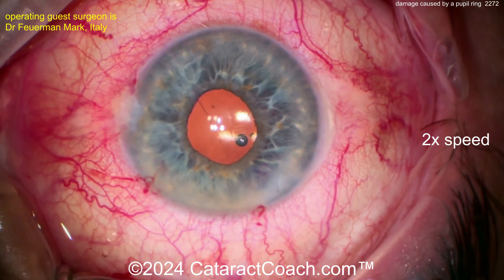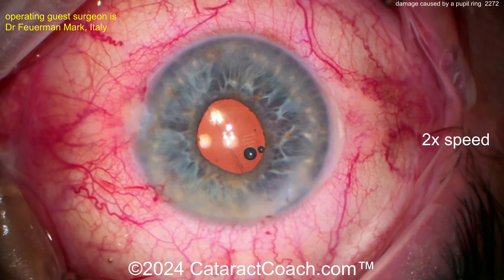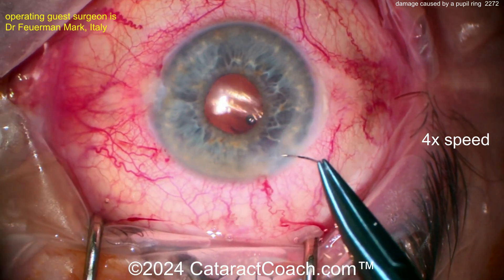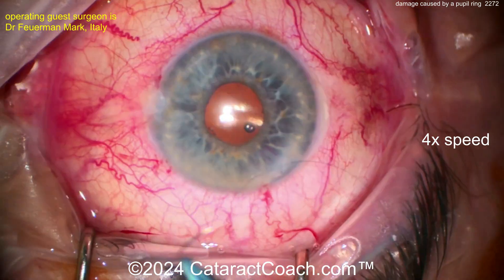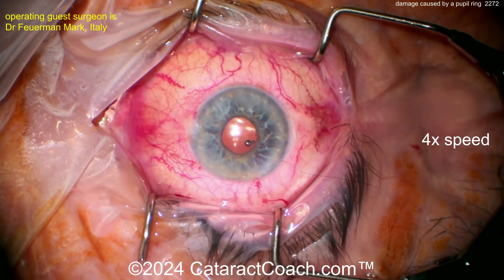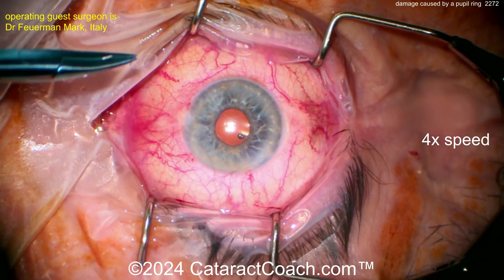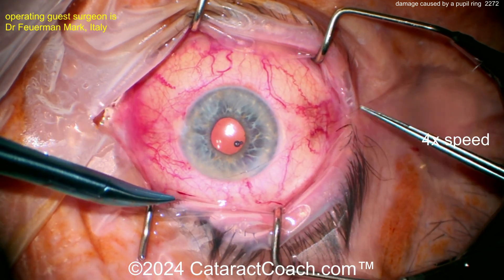Now look here — it looks like a good case, but will the incision seal up? If you look carefully, there's a cut to the roof of the corneal incision. The better part of judgment here is to get a suture in. I even like the horizontal mattress suture — that's a great idea. Nice draping, eye in primary position. Take note, young ophthalmologists — you should be draping the same way. Tying up this suture is going to give us good closure of the incision.